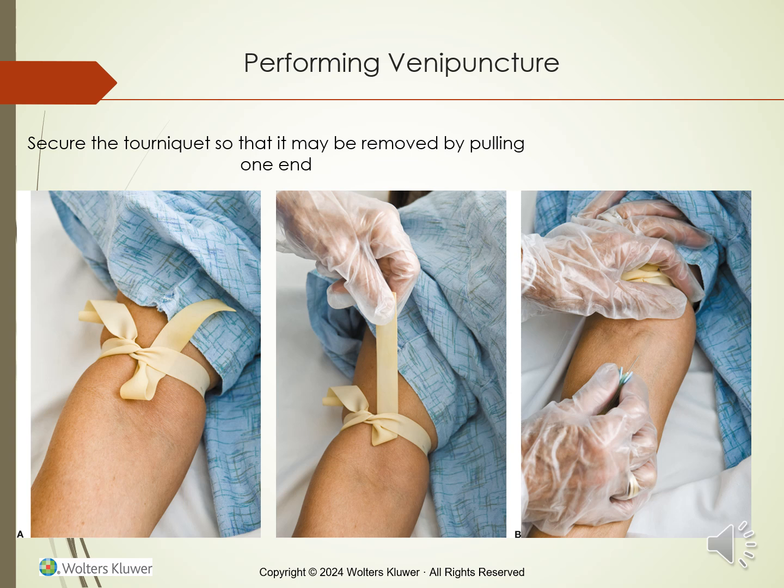They can just be regular medical gloves, but ensure that all other equipment used for cleaning or puncturing the skin is sterile. Use an antiseptic or alcohol swab to cleanse the area, and apply firm strokes from the center of the site outward using a new swab each time, and repeat this at least 3 times. So clean the area in a circular motion, and you want to let it dry.